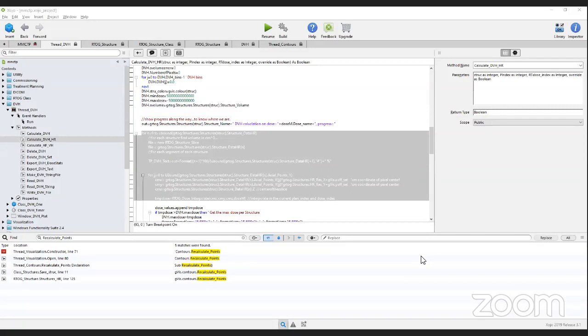But the other way of calculating a volume is to look at those contours, the edge of the contour, and calculate an area per slice, and then sum that up. And so that's one method of using a geometric calculation of volume.